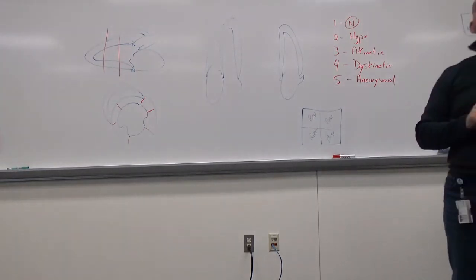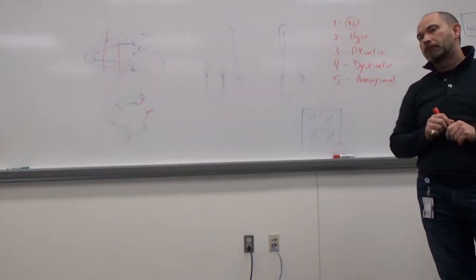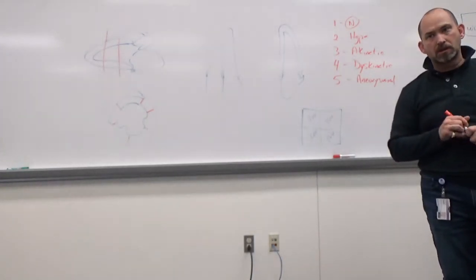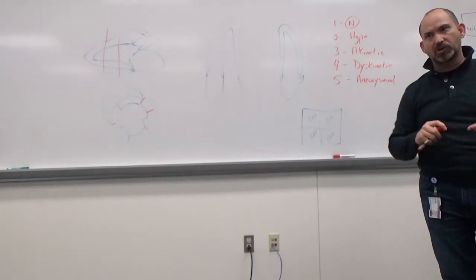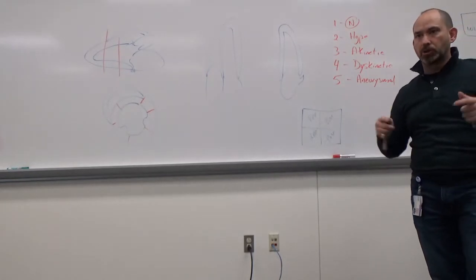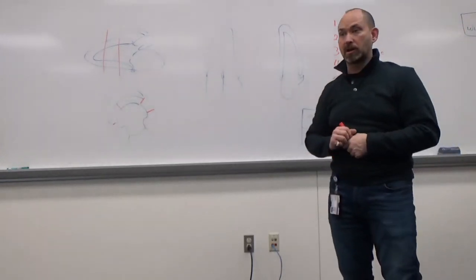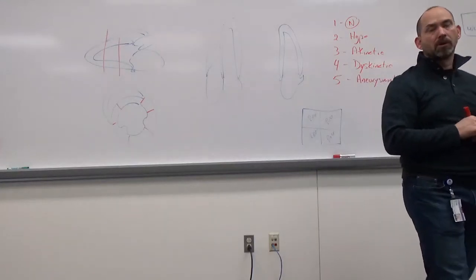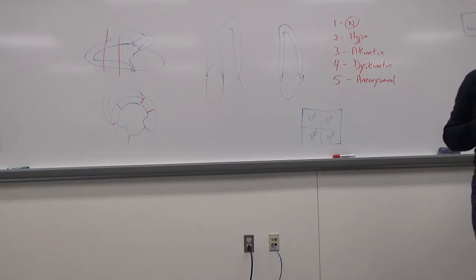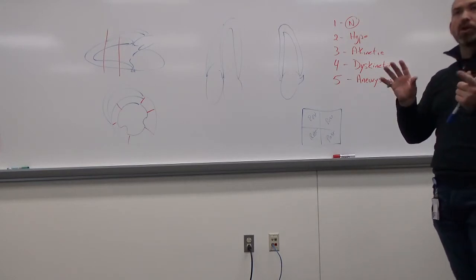So if someone has had a heart attack and they have akinetic walls, do you exclude that from your calculation? Nope, still part of it, because it still affects the hemodynamics. So the question is, if there is permanent damage, I've got scarring, do I exclude that information? That's definitely included because it's affecting the overall dynamics of cardiac output. So yep, we definitely do it. But we expect it. So we're not surprised to see that their EF is at 45 instead of 65. So you just compare it to their last known ejection fraction? Yes. Ejection fractions and wall scoring too.